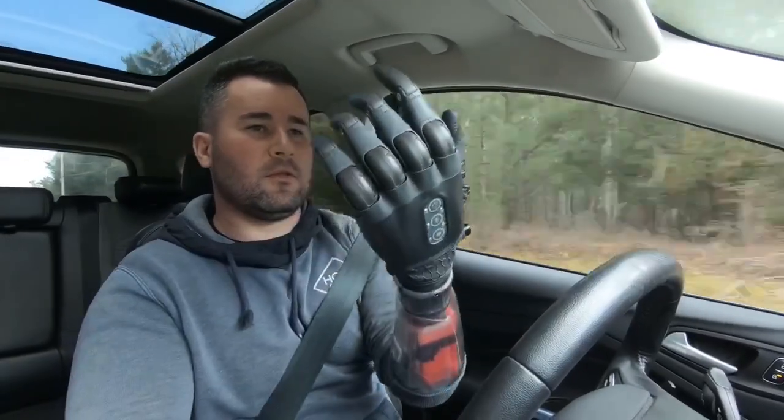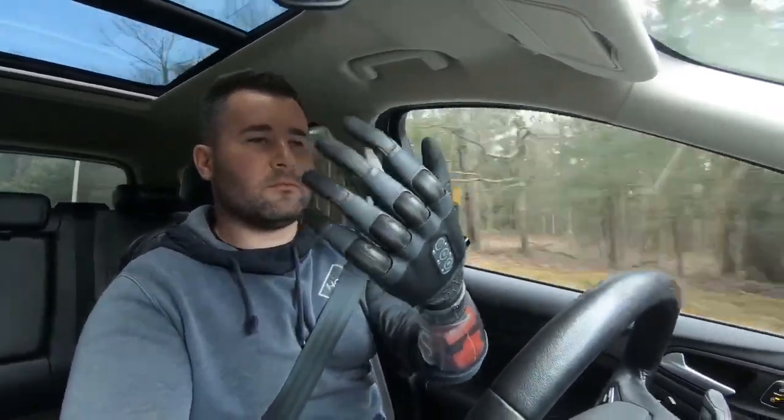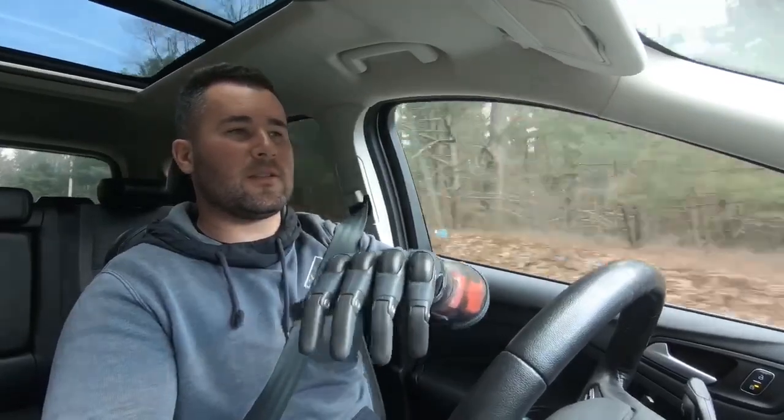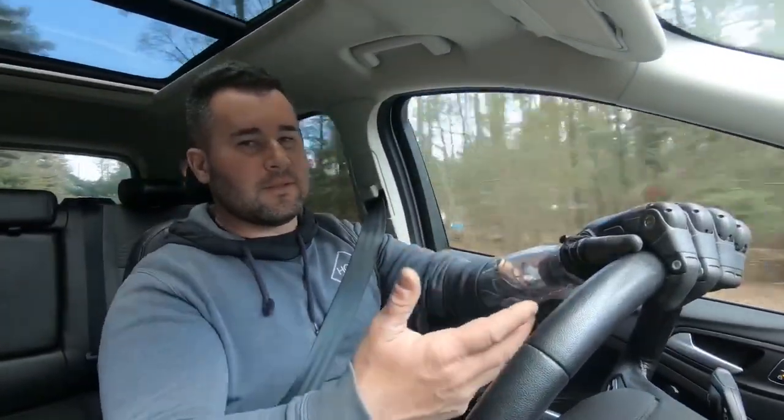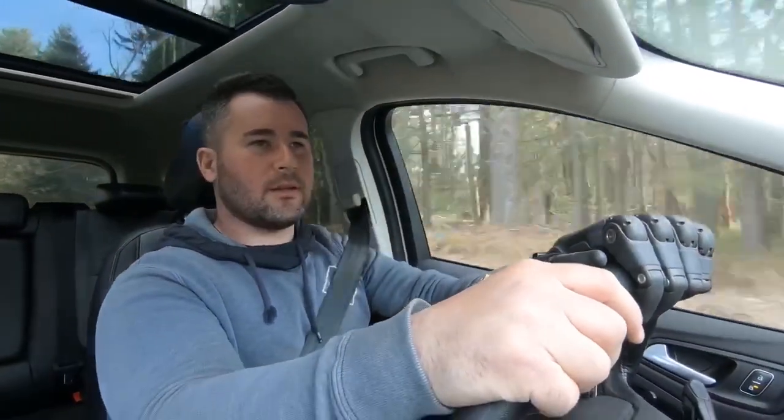This hand is waterproof without a glove — basically, as you see it, it's waterproof. All the other hands need a glove to be washed or do dishes, whatever the case may be. So it's a big step in the prosthetics world. However, a con is that without a glove, if you use it daily, it can get nicked up, scratched, you can leave dull marks on it.